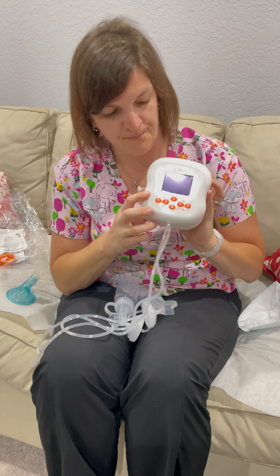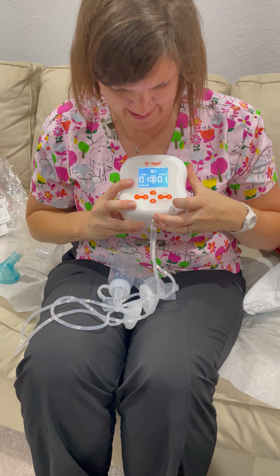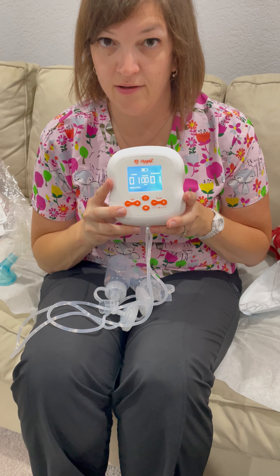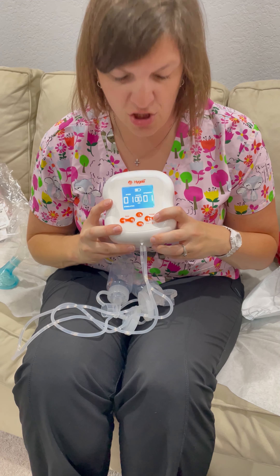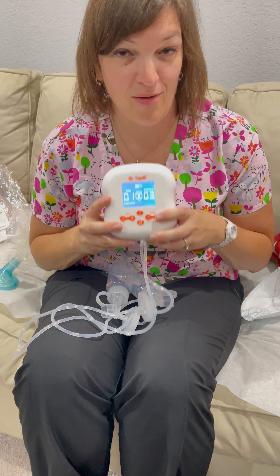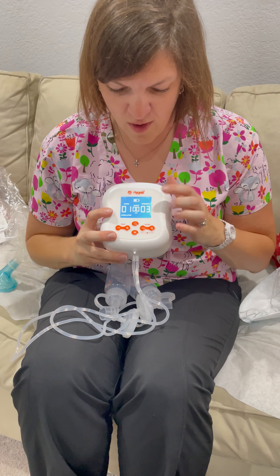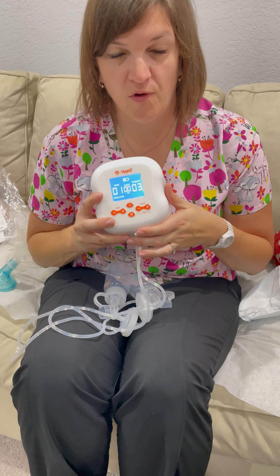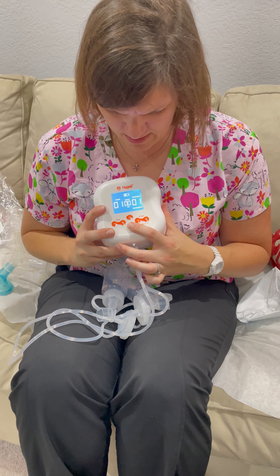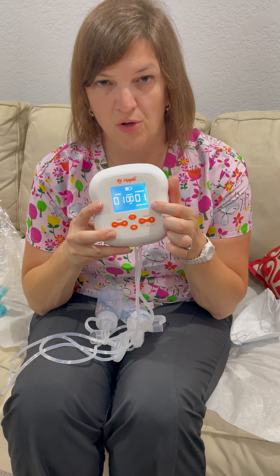So this is the Hygeia Evolve. When we turn it on, it's going to start in a stimulation mode. Stimulation mode is the quick cycle to try to trigger your letdown. You want to have this suction comfortable, but not sucking your brains out — more is not better. Once you have it on this stimulation mode for one to two minutes, or you start to see your milk flow, then you're going to hit the M button so that it goes into the expression mode.